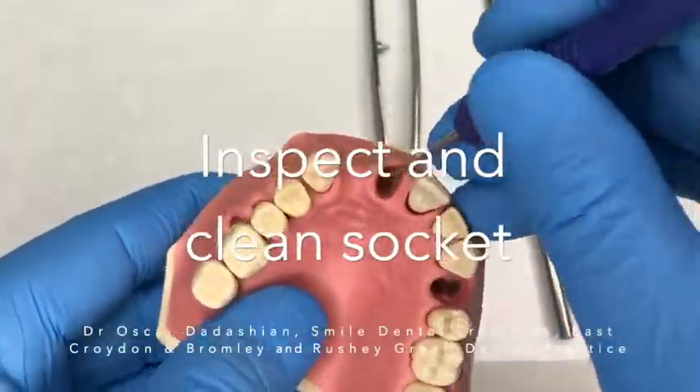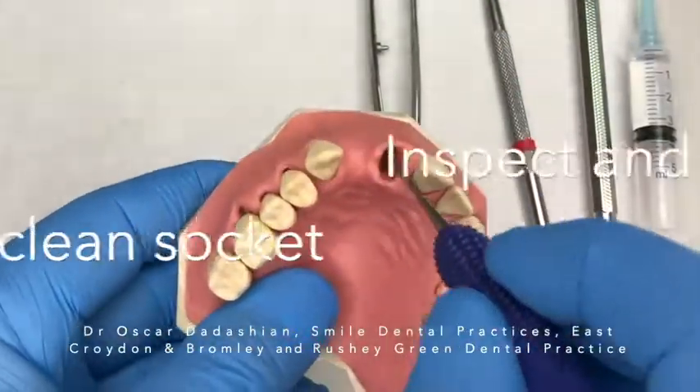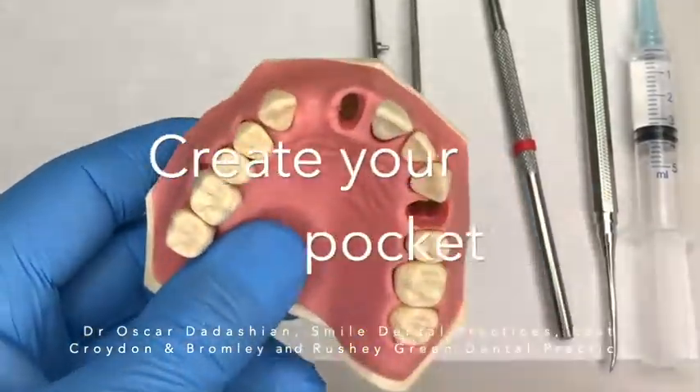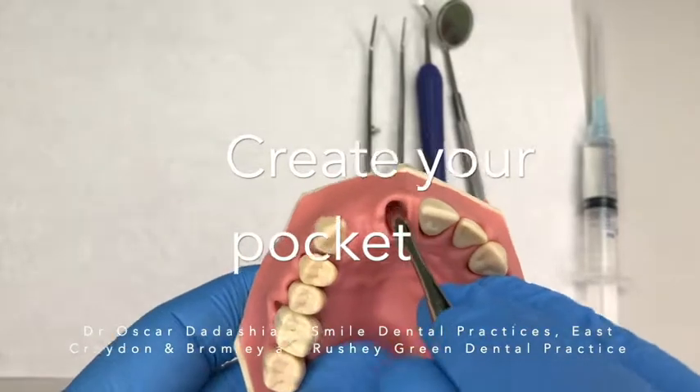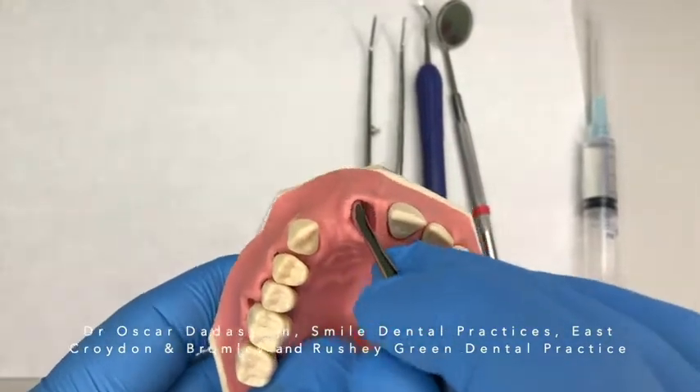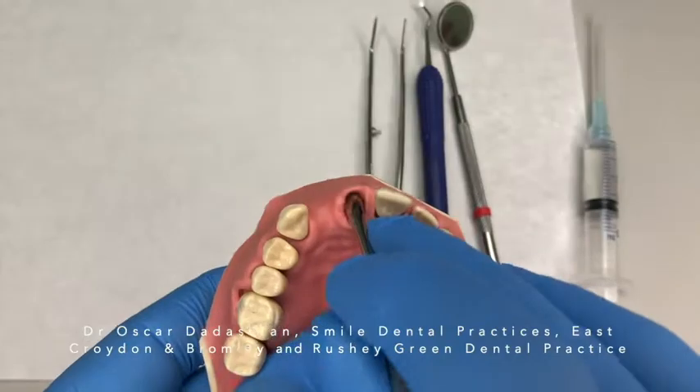Here we are doing a ridge preservation — first inspecting and cleaning the socket, then creating a pocket between the bone and the soft tissue. In this case I'll be using a xenograft, the Bio-Oss collagen, that I'm going to cut into pieces and place into the socket.